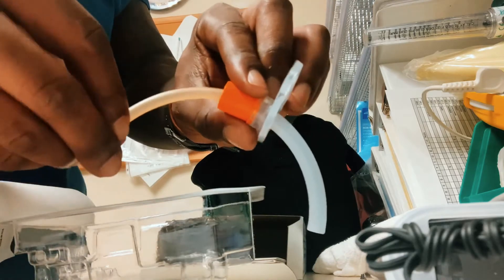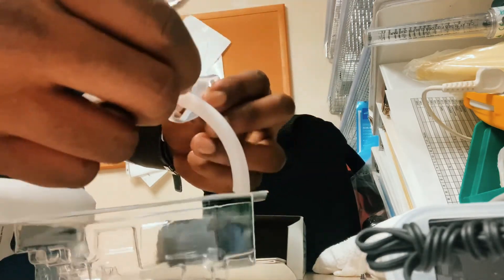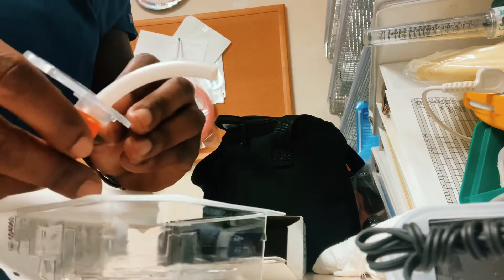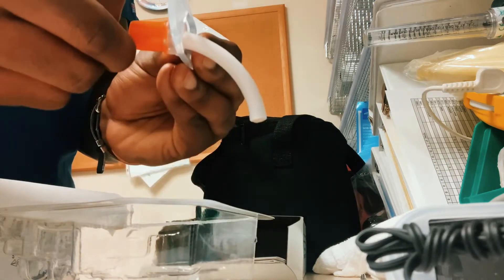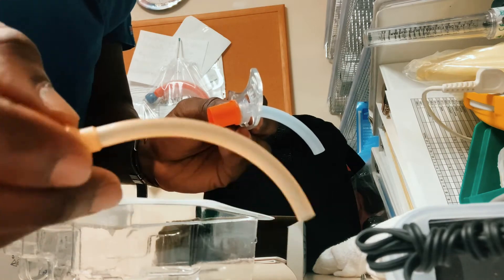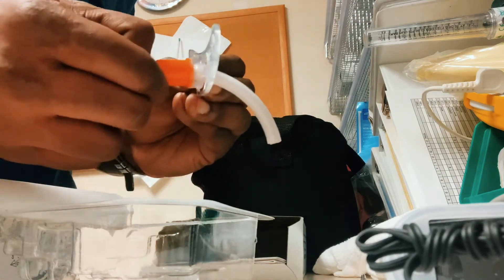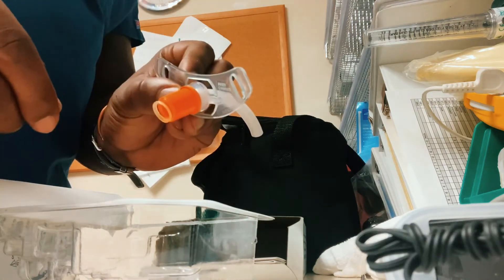Then put the inner cannula in. The trach ties are usually put on with person-to-person assistance, because you want to make sure you hold the trach in place — the patient may cough and the trach may come out. If the patient's secretions become thick and tenacious, we can remove the inner cannula and put a new inner cannula in. Sometimes people insert it from the side and straight on in, but just follow down and insert your inner cannula.